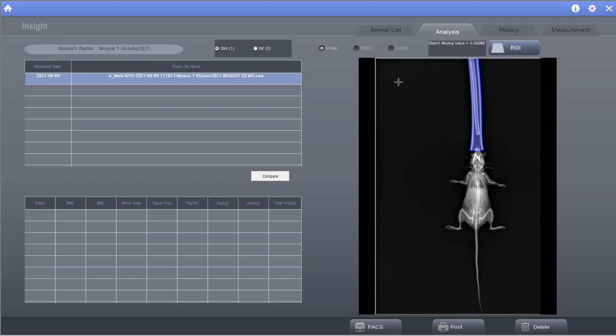We're going to go through all of the different measurement capabilities of the system. And then Val, again, is going to join us in a few moments to discuss some of the data that he's gotten with the system. So the first thing that you can see is that the nose cone is actually colored purple. This is the color of the exclusion ROI.